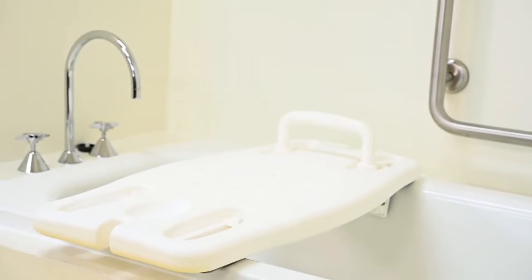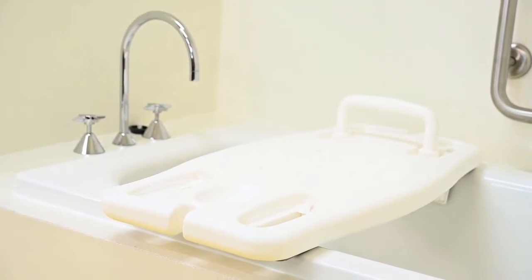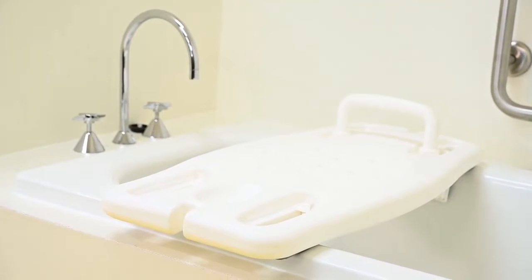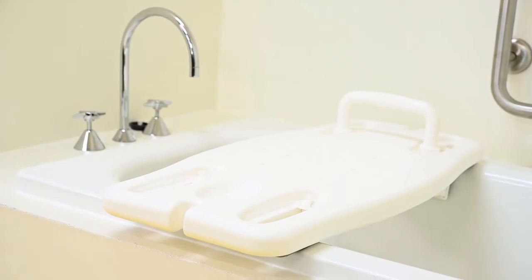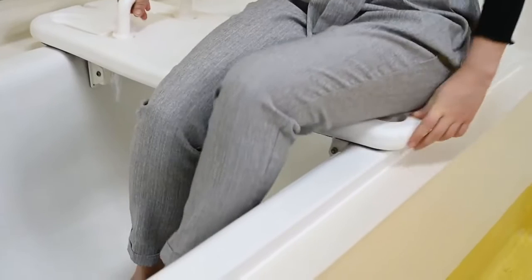Bathboards are used to improve your independence and safety transitioning in and out of the bath. It provides a seat for you when you are using a shower over the bath. Bathboards are only suitable for a standard regular bathtub, as shown here.